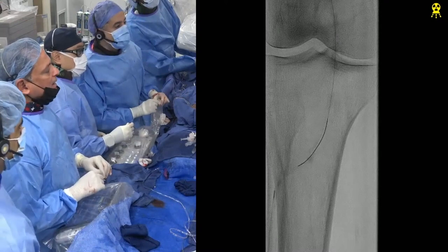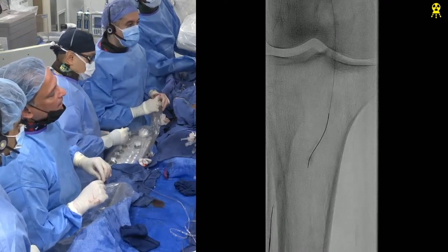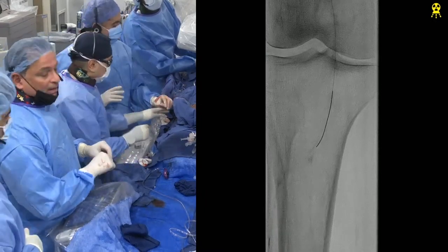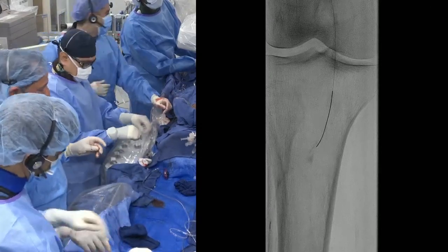No, the catheter is down there, PK. Catheter is in the AT. Hold on a second. Let me get the catheter. We ballooned this. Please do not cross. I'm not. Give me a... what is it called? A command wire.